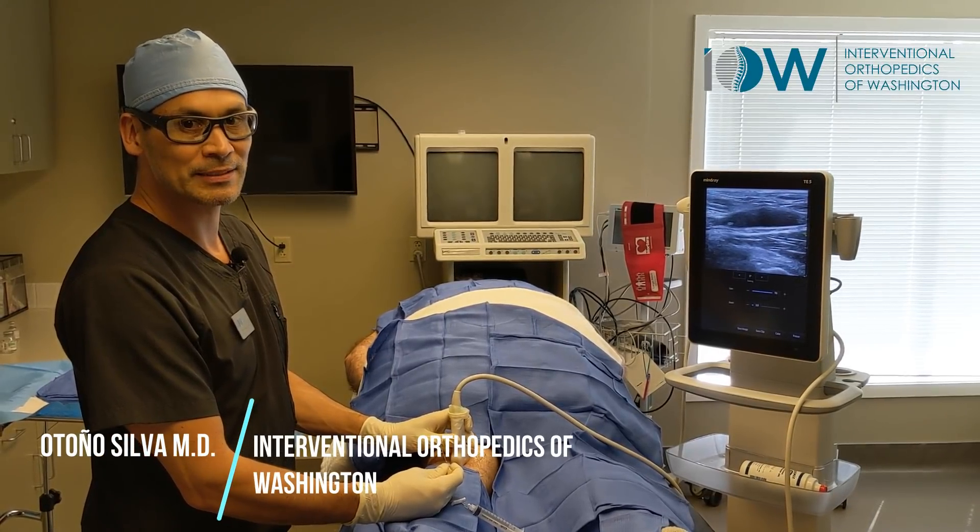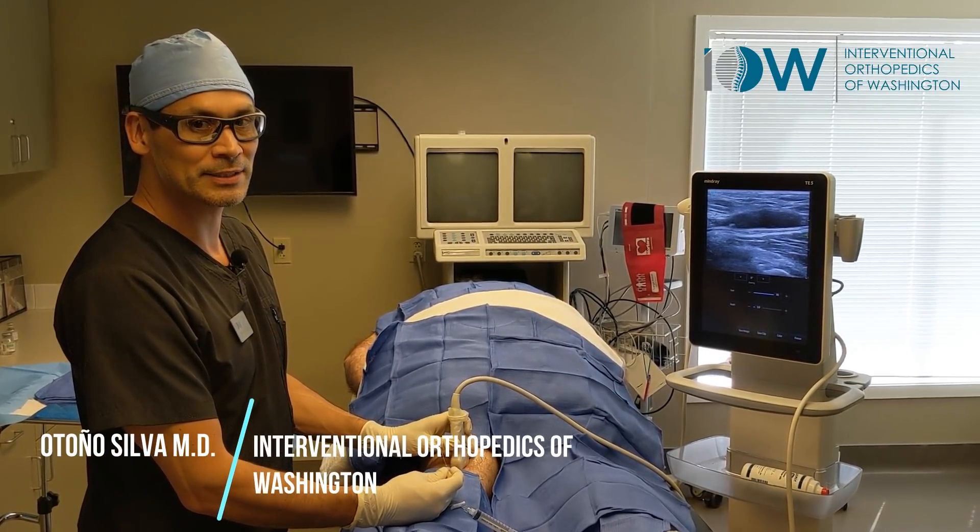Dr. Silva here at Interventional Orthopedics of Washington, where we're doing a Baker's cyst aspiration.